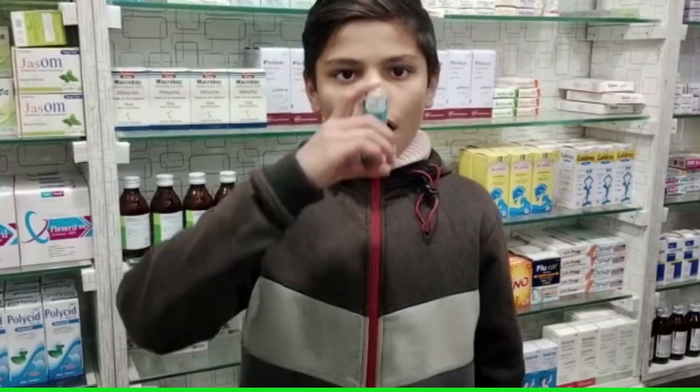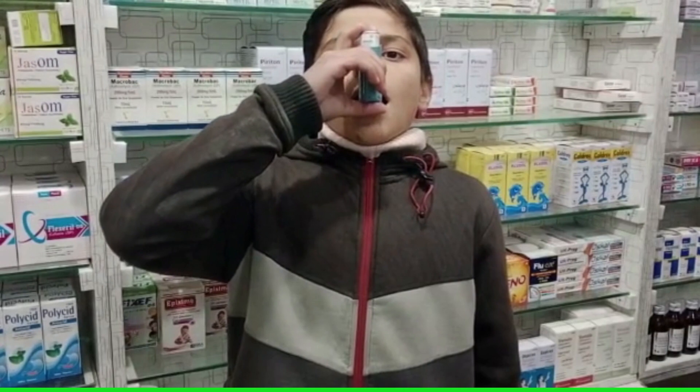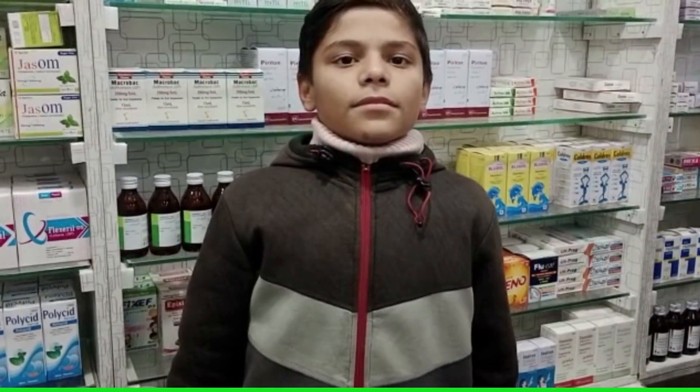Sit up straight or stand up. Put the inhaler in your mouth, press the inhaler, and start breathing in at the same time. Take a slow and deep breath.